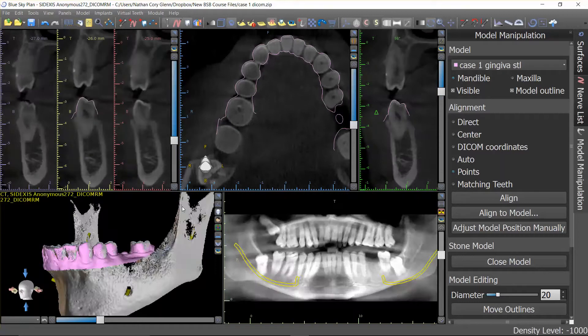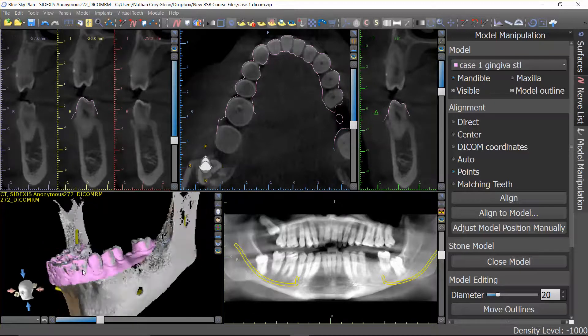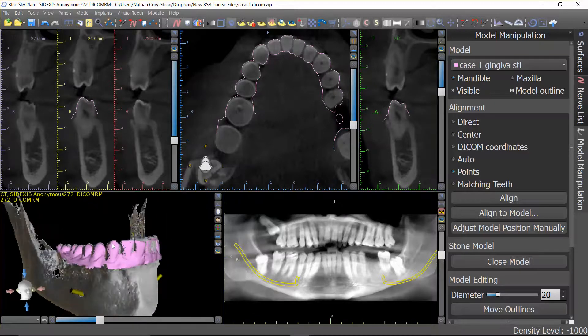It's always wise at this point to go ahead and save the case, because once you've completed important steps like that you would hate to have a crash and then have to come back and redo any of it.